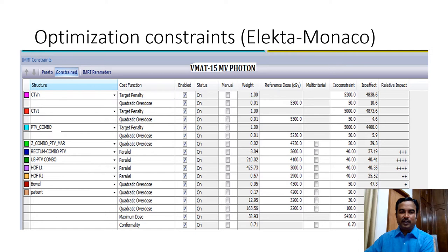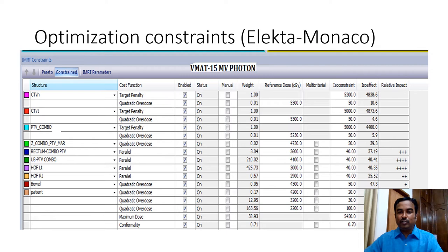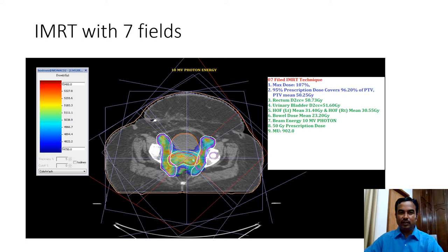This shows the optimization constraints used in our institution with the Monaco planning system. Caution should be given to the patient body structure using three layers of quadratic overdose, as this helps in controlling the low dose area. Since we use multiple beams and arcs, without proper attention the low dose area may tend to increase. In most clinical settings we do not look down to 10% of dose — for example, if delivering 50 Gy, we would not check down to 5 Gy to see how far it is spreading. By giving stringent constraints to the body, we can control low dose spread in VMAT and IMRT.